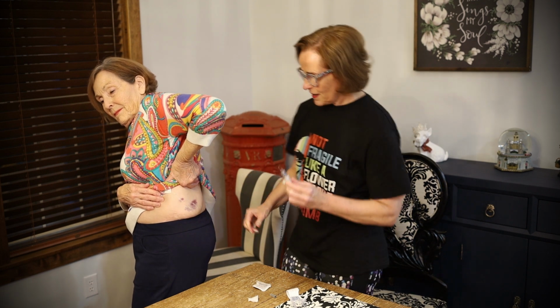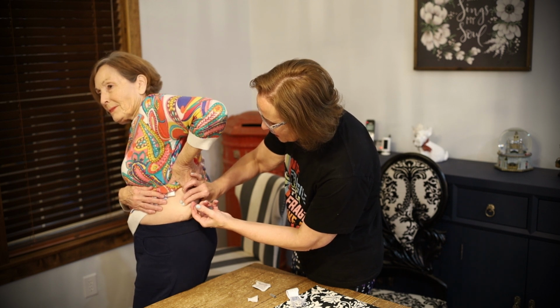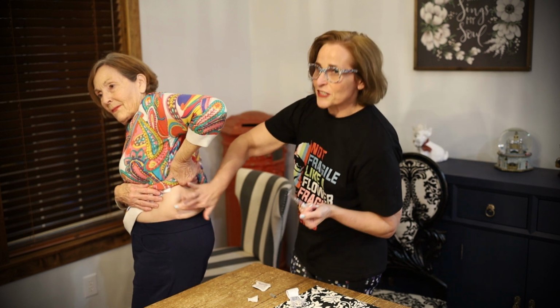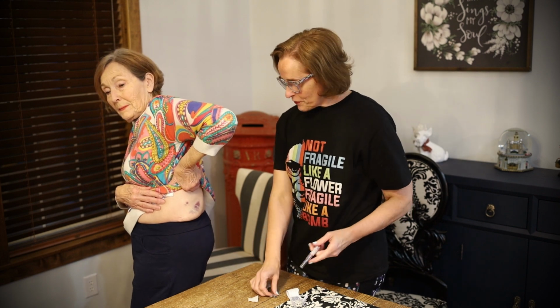0.7. And then you want to grab some skin. I got plenty of skin. And inject. And then when you push it down, I like to rub it in too. They say it doesn't make it hurt as much that way. And then I hardly felt it. We're off to the races.